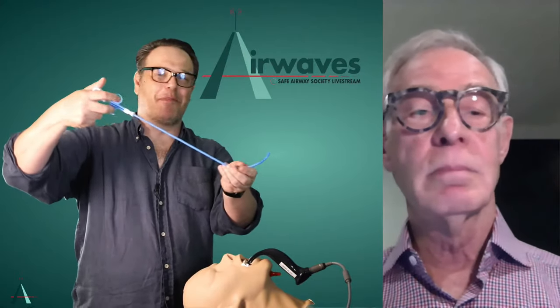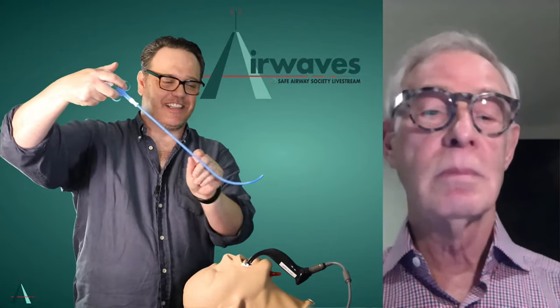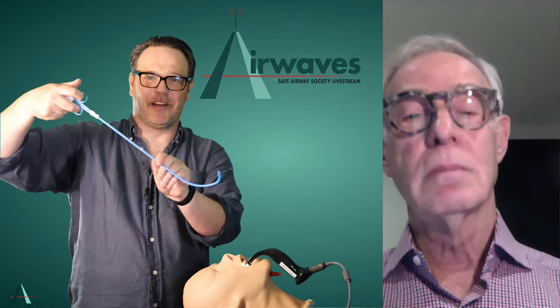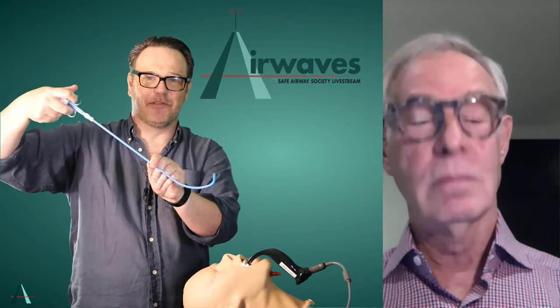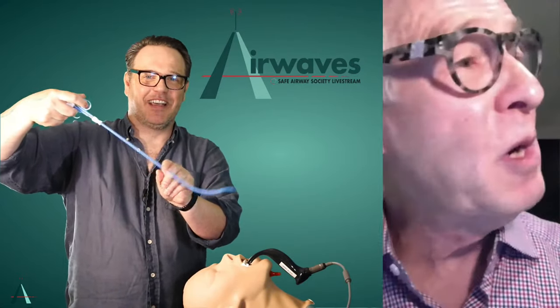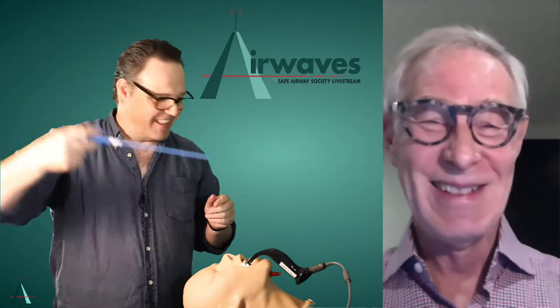I'll show you one more thing. I don't know where I got this from, but just so I'm not monopolizing devices, this is a stylet that's very similar to the GlideRite, but I don't know if you can see, it's got a sort of steerable tube. It looks like a laparoscopy bit of equipment. I have one on my desk here too. Oh, you've got that too. I haven't used this clinically. I don't think this is licensed here. I think it was given to me at a conference. Is that something you've used? No. Same thing for me.